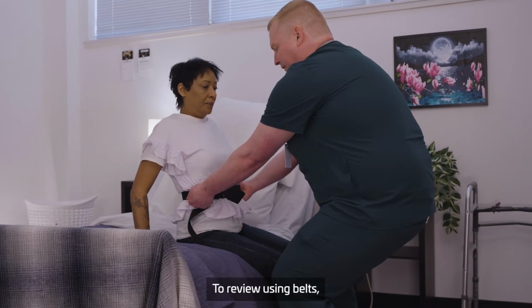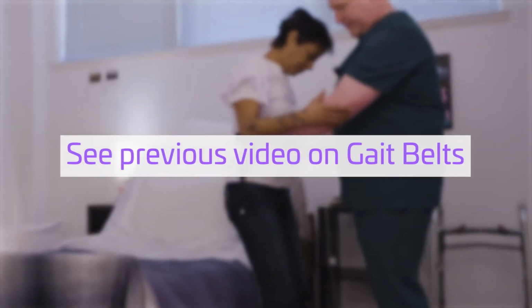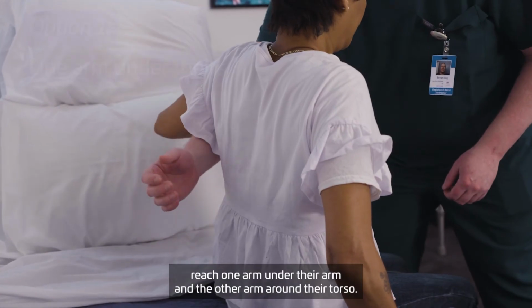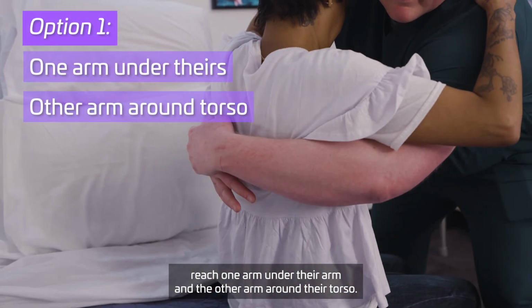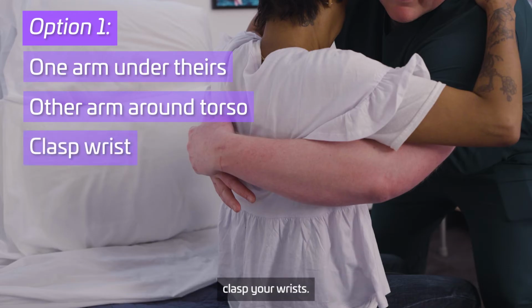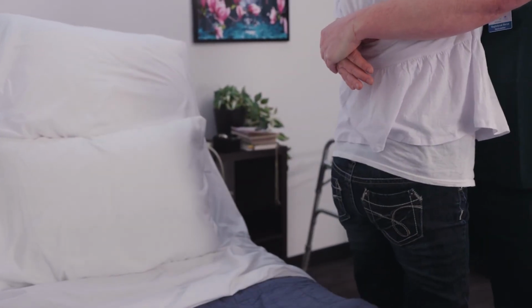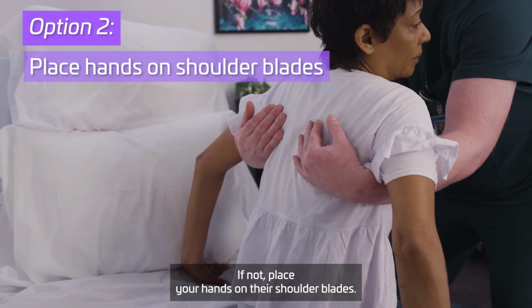To review using belts, see the previous video on gait belts earlier in this course. If you are not using a gait belt, reach one arm under their arm and the other arm around their torso. If you can reach all the way around their torso, clasp your wrists. 1, 2, 3. If not, place your hands on their shoulder blades.